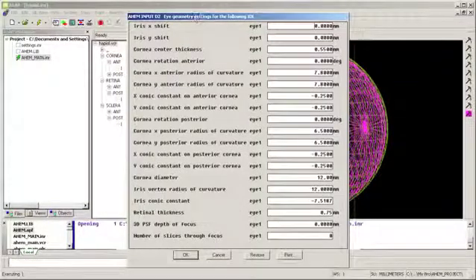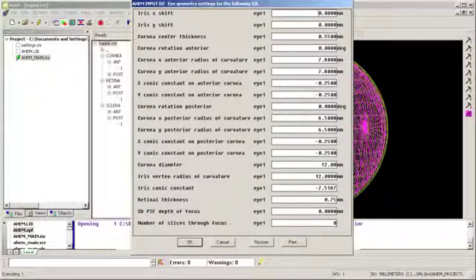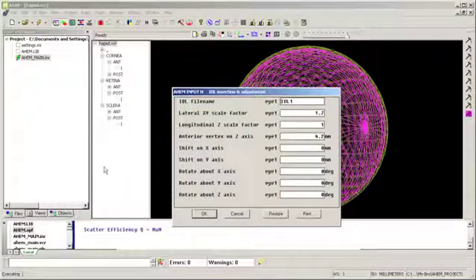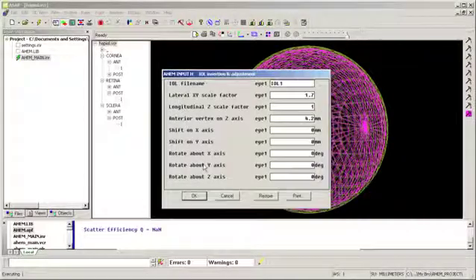And now I have some particular settings for an IOL in my next input. I can shift the iris if I wish, and then various other geometry associated with the eye. Click OK. Now it's asking me for some more detailed information about the intraocular lens. So I can generate an IOL from some other CAD file and call it here. So I've got a lens called IOL1, and I can also scale that lens. So if it's a small lens and I want to make it larger, I can put a scaling on that, and I did that here, 1.7.